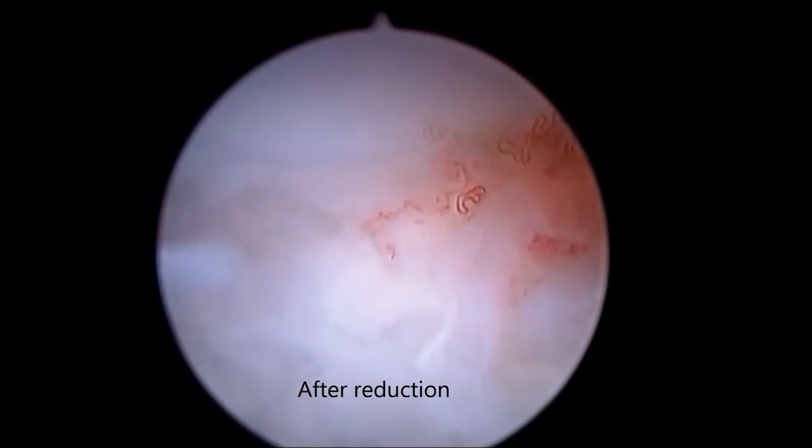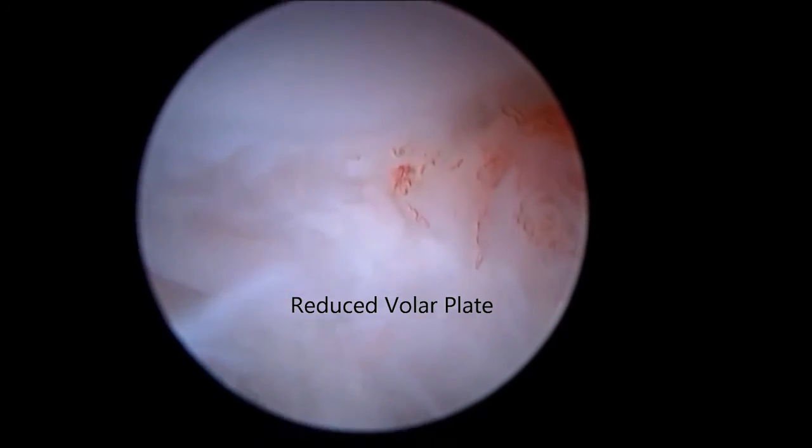This is after the reduction. We could see a normal anatomy of the MCP joint.